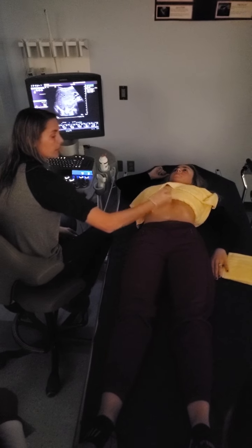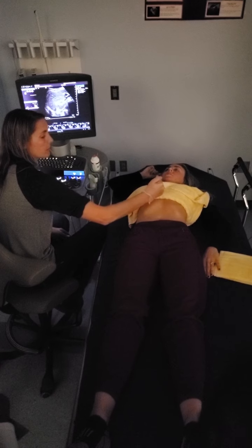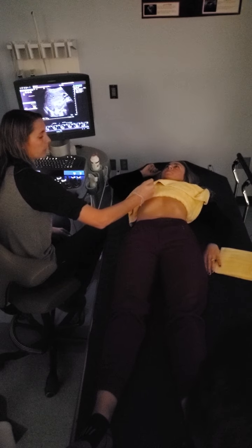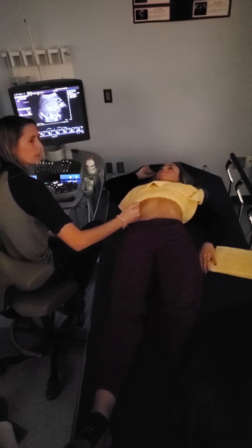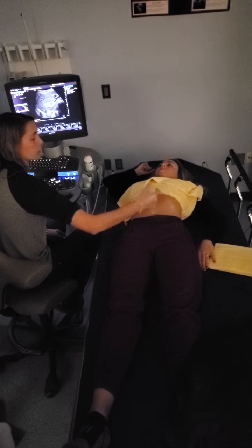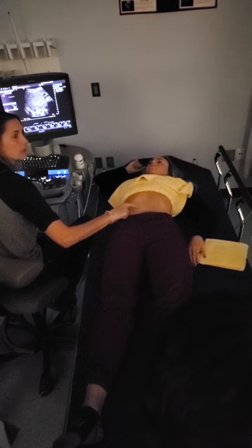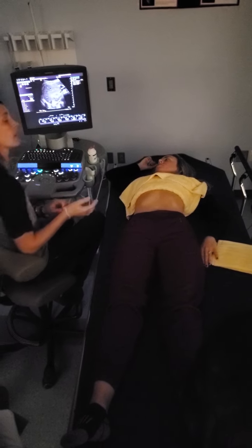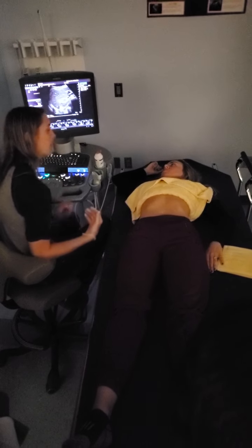Now let's talk about this right side. We cut things off, right? So we had to go superior. We did a medial, a mid-medial, a mid-lateral, and a lateral. Then we slid down and did a medial, a mid, and a lateral, and that's subcostal. We did transverse. She didn't have a very good window because she's so tiny and cute. And so I had to kind of slide down and get all four of my images from that subcostal margin. You could also do, and next week we'll work on it, what's called intercostal, where I can actually go into the rib spaces and evaluate.